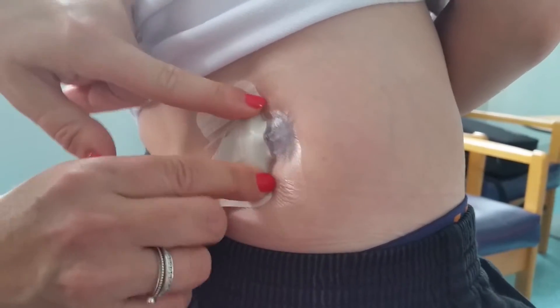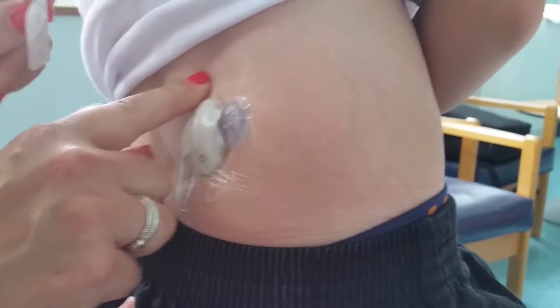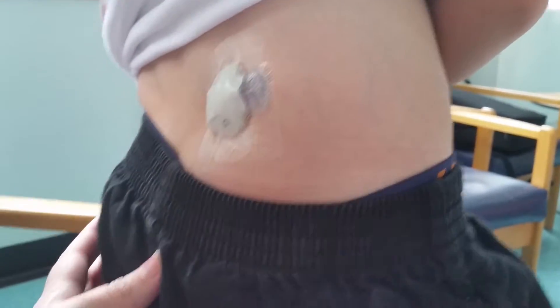There's a lot to remember, so I think it was perfect. I never even thought of suggesting to parents: why don't you video this for yourself so you can look back at it later? That might be a good idea. And it's totally waterproof — all done!